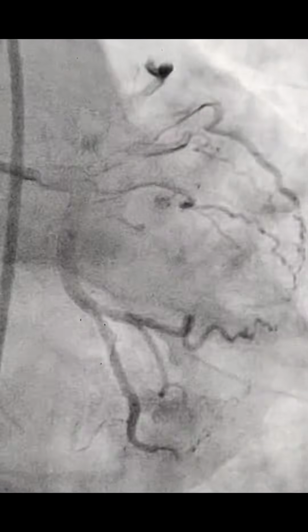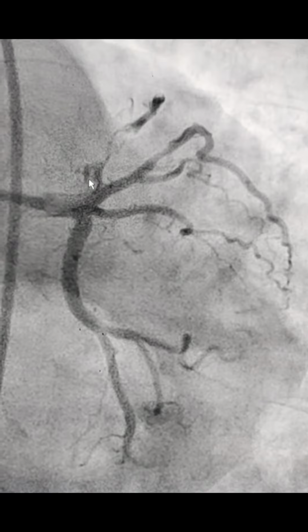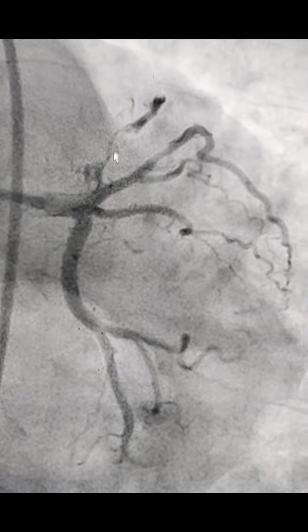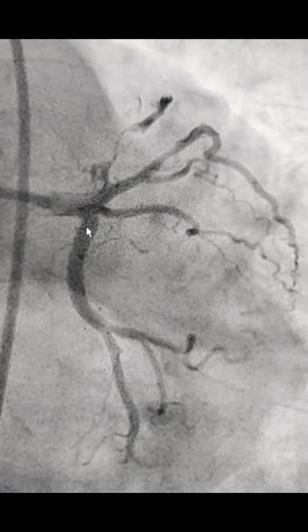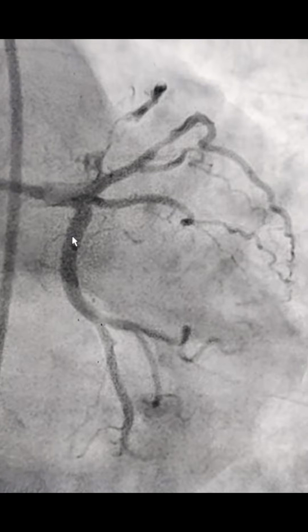So this is an angio after 12 hours of GP2B3 inhibitor, tirofiban, and you could see there's a magic: the ostioproximal thrombotic occluded LAD lesion has opened up. So this is that major LAD which has opened up from here, and this is the LAD, and this is your second LAD. Here is the lesion in the second LAD, and this is your ramus, and this is your LCX. So it was decided to do the angioplasty to both LADs.